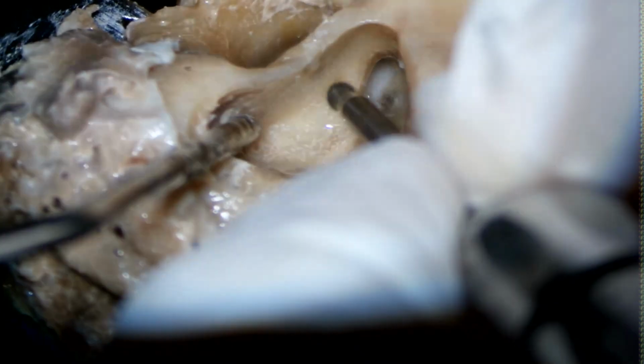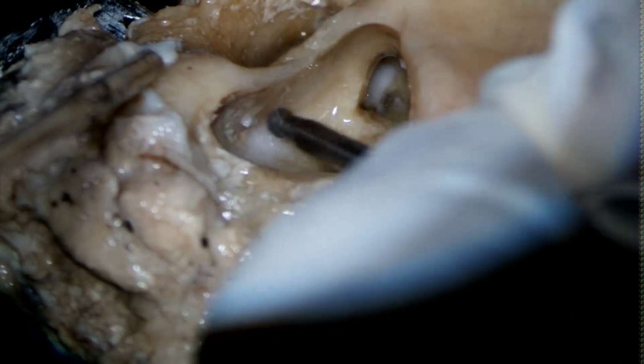There is still a lot of bone. There is a lot of bone to be drilled. More thinning of the canal is needed now.